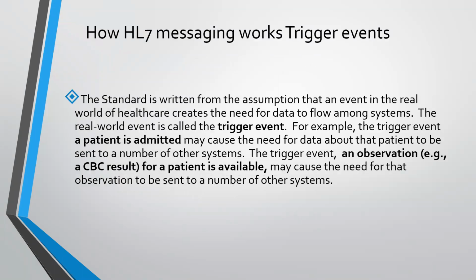So now that we have understood what HL7 is, where we use HL7, and why we have the name HL7, we looked at the problem and all. But we need to understand the basic principle based on which HL7 works. Structure is okay. It is used in data integrations, in simple terms, to send or throw data from one application so that the other person on the other side can grab that data and display it in their application. But how is this happening? What is the basis of it?